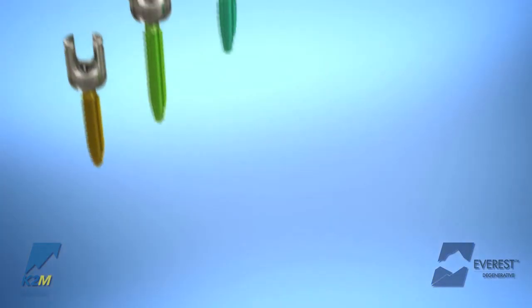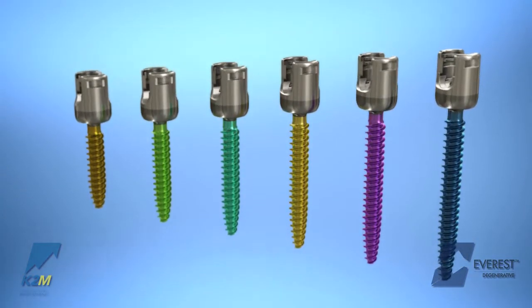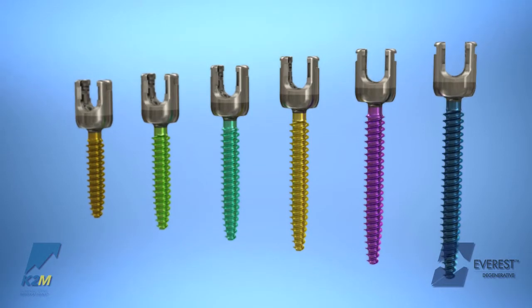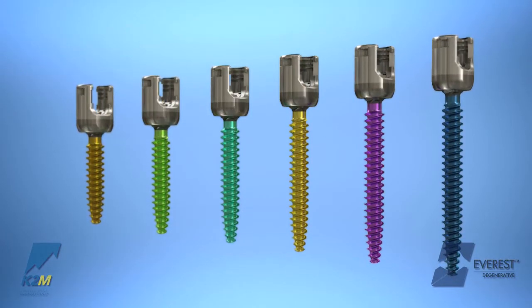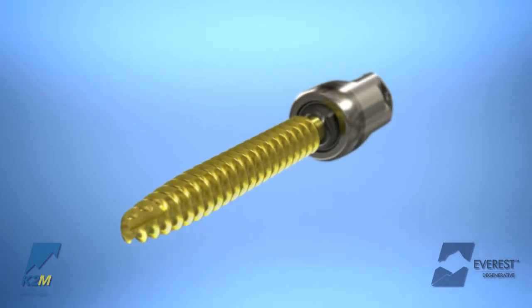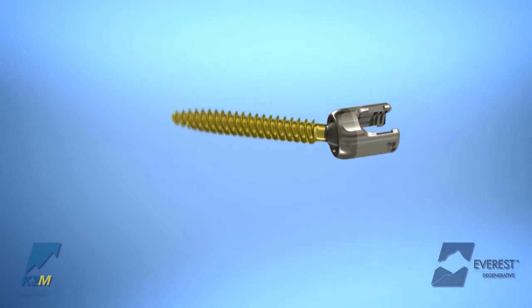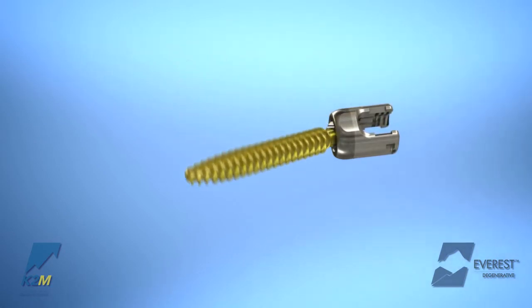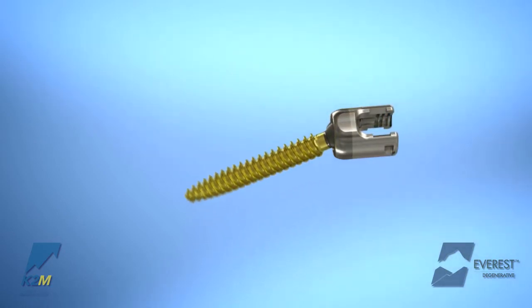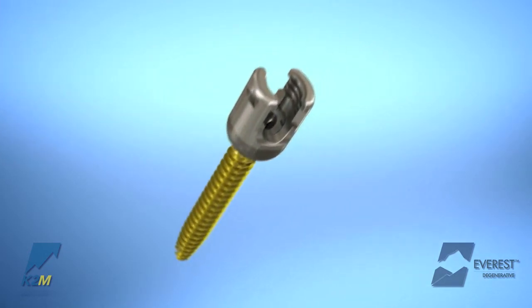Everest screws are available in multiple lengths and diameters. Screws are color coded by length to allow for quick and accurate implant identification. The Everest screw utilizes an optimized dual lead thread pattern and provides 70 degrees of polyaxial range of motion, allowing for greater flexibility in screw placement intraoperatively.